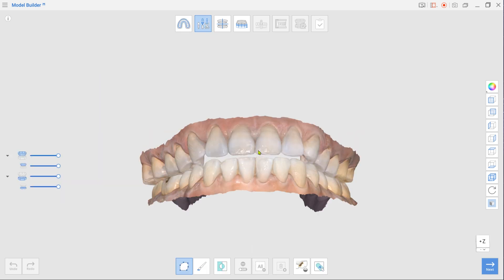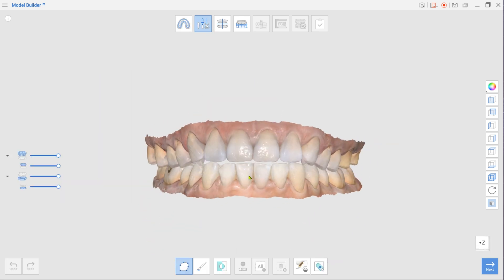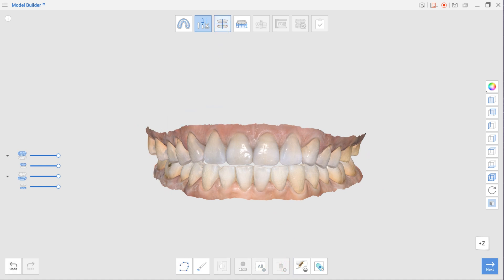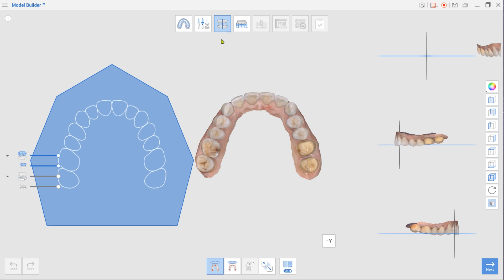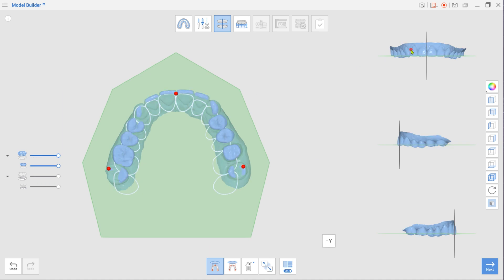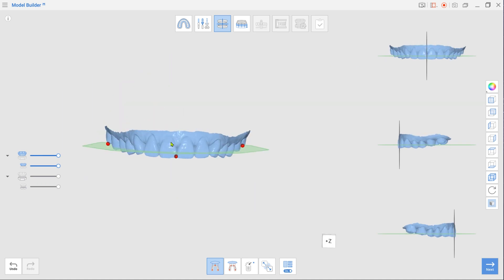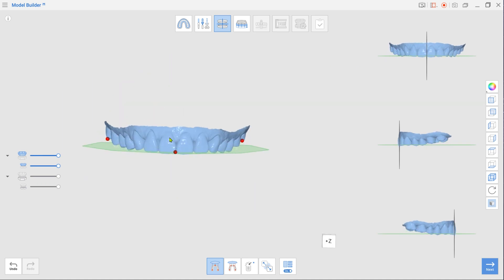Click Next to move to Edit mode, where you can trim the scan data or fill in holes. Once done, move to Alignment mode. Select three points on the data as shown in the video to align it with the virtual occlusal plane. Ensure the data is properly positioned by reviewing it from all angles in MultiView.